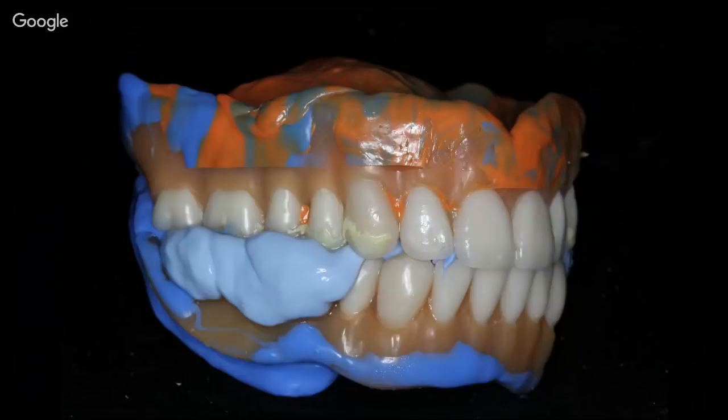Now, whereas I used to have to duplicate it, so that I could pour this up and generate master models and all of these things, if we're going to do this in a pure digital manner, I can now take this back to the lab or use your intraoral scanner and immediately image this and digitize all of this data within 10 minutes or so. And then we can peel out the impression material, give the patient back his existing dentures, and he can go on his merry way until we see him the next day for delivery of the final dentures.